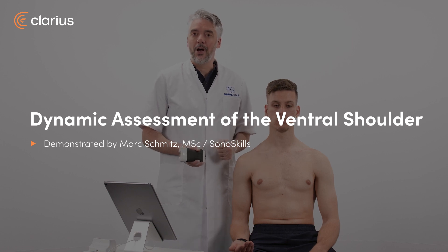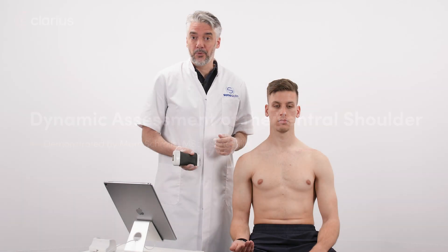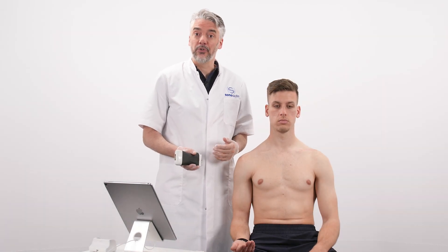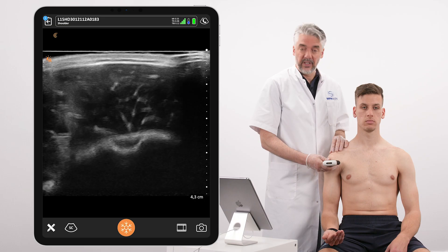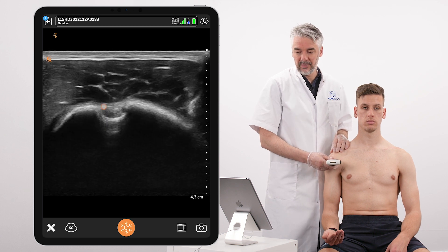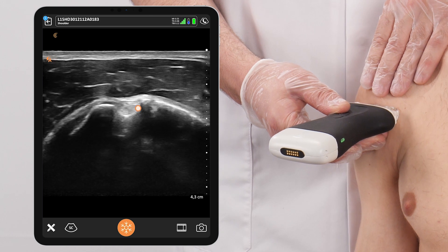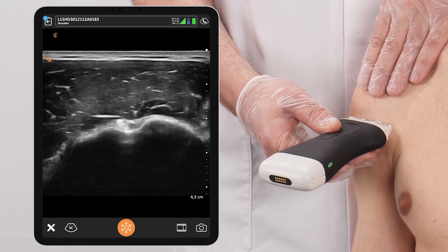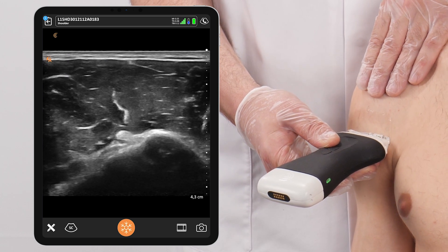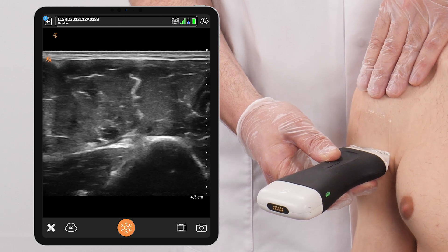In this video I'm going to show you how to scan the ventral shoulder in one sweep and we're going to activate the patient so that you can also see the soft tissue anatomy dynamically. We're going to place the transducer in short axis plane over the intertubercular groove, then tilt in order to make the tendon hyperechoic. We're going to follow the long head of the biceps distally and observe for fluid accumulation around the tendon and also for capsular changes due to tenosynovitis.